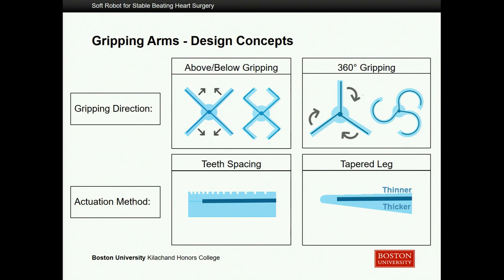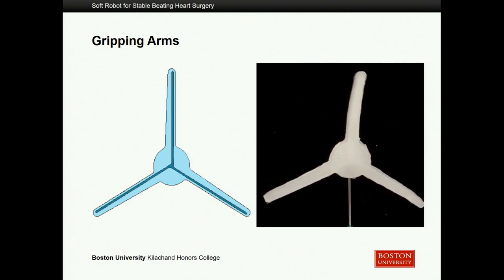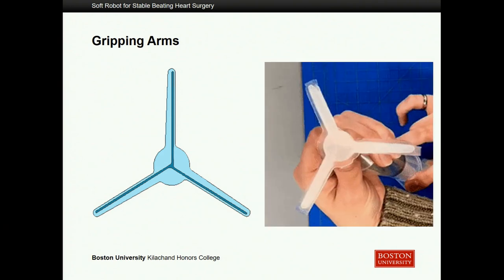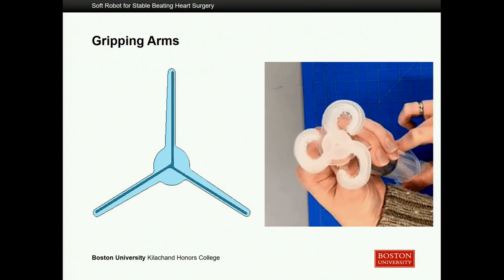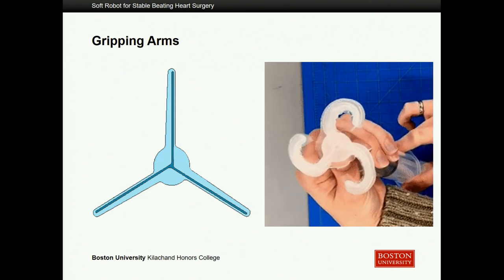To achieve a 360° grip, we needed variable resistance along each leg. We considered doing it with teeth spacing, but that was a manufacturing nightmare. What we wound up doing was a tapered leg where one side becomes thicker as it gets closer to the center. Here you can see that device working — on the right side is an actual moving image of the device we're making. It has an air input through the bottom, which disrupts the 360° motion slightly, but once air is being input through the center underneath the actuator, it does complete that 360° wraparound motion as expected and desired.